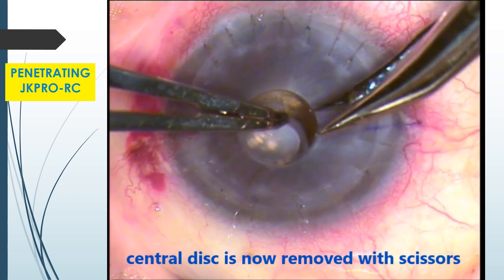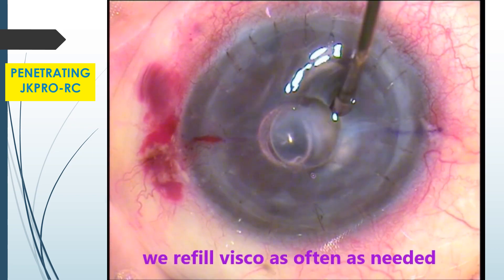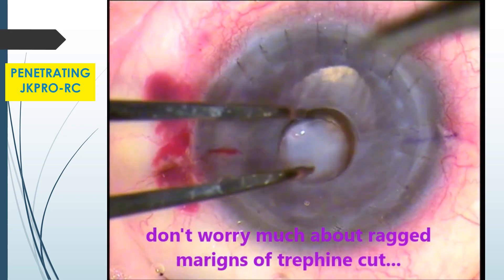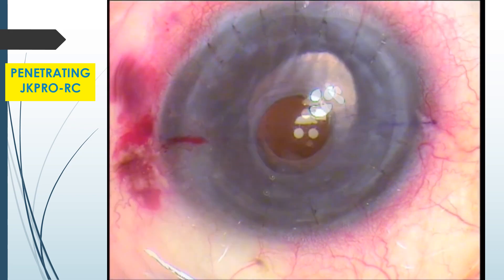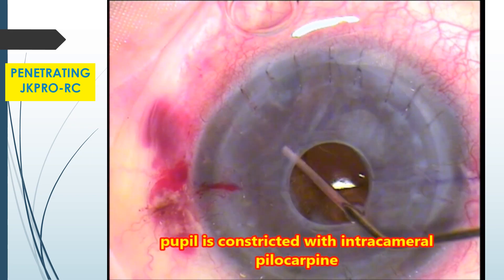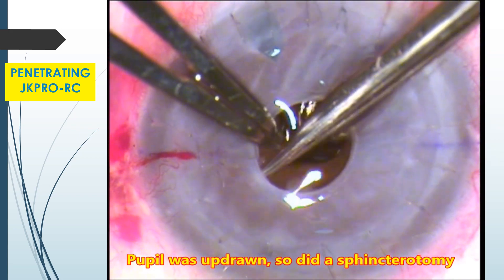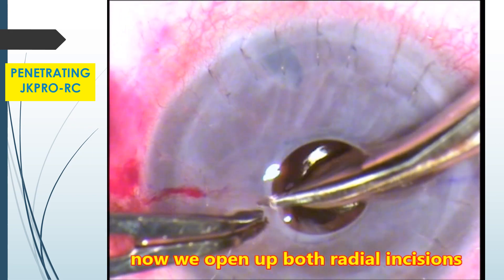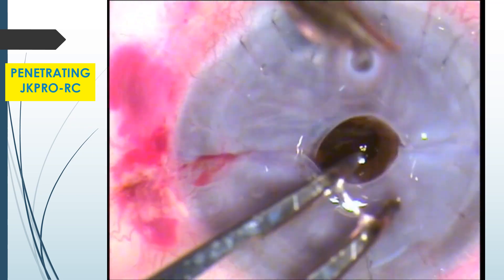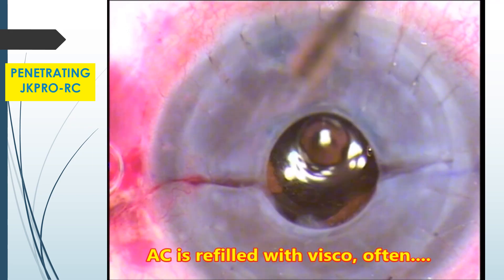Central disc is now removed with scissors. We refill visco as often as needed. Don't worry much about the ragged margins of the trefine cut — in fact, we want a little ragged margin. Pupil is constricted with intracameral pilocarpine. Pupil was updrawn, so we did a sphincterotomy. Now we open up both the radial incisions.